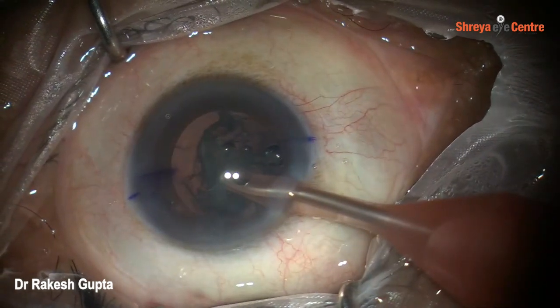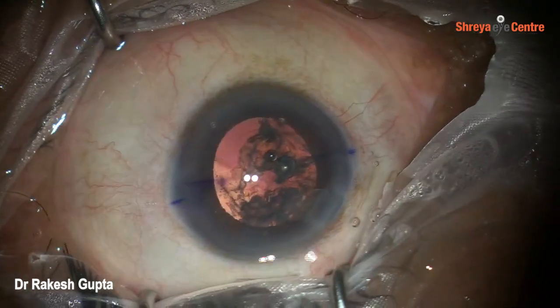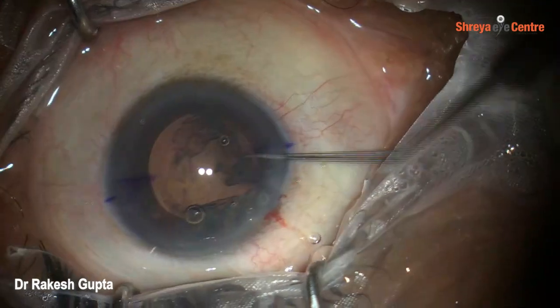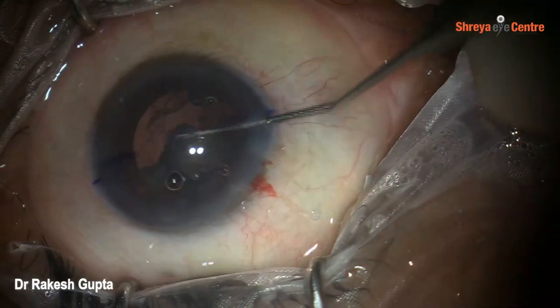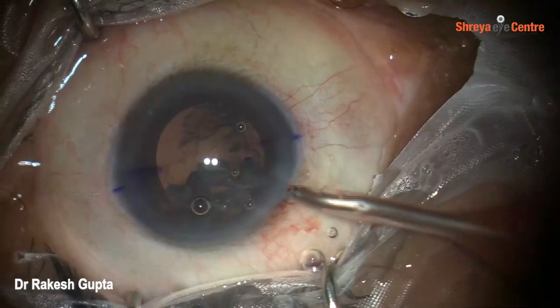Because the cataract is soft, I am aspirating the cortex intermittently while I am injecting Viscoat repeatedly to keep the capsule backward. And now I am gaining confidence that probably I will not need to do anterior vitrectomy, because till now the PC rent has not extended and I have been able to remove a major part of the cataract.